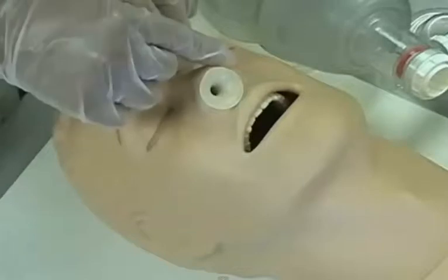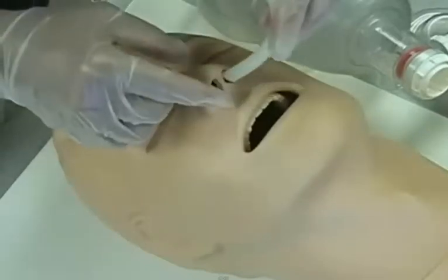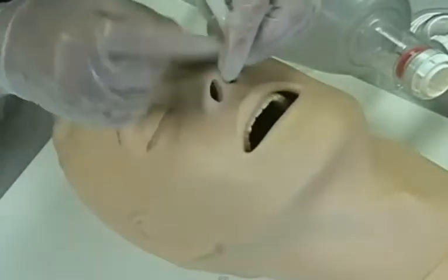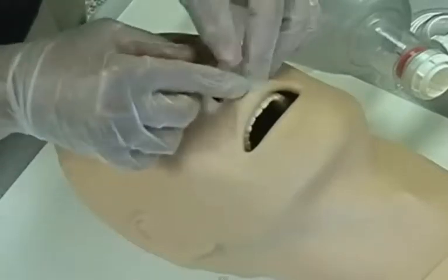If we had to use the left nostril instead, then we would turn the bevel to the septum again to avoid damaging any structures, and then we would rotate as we move in place 180 degrees.